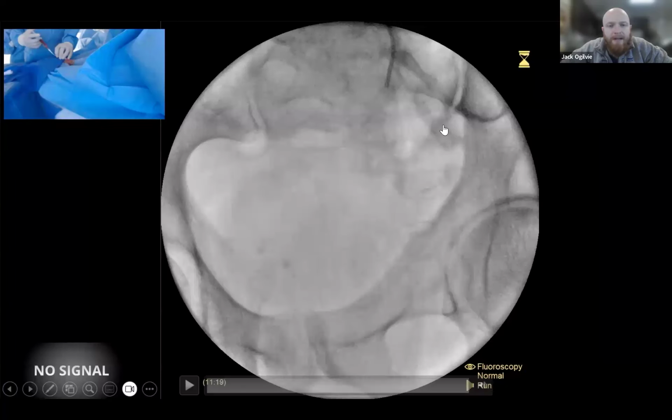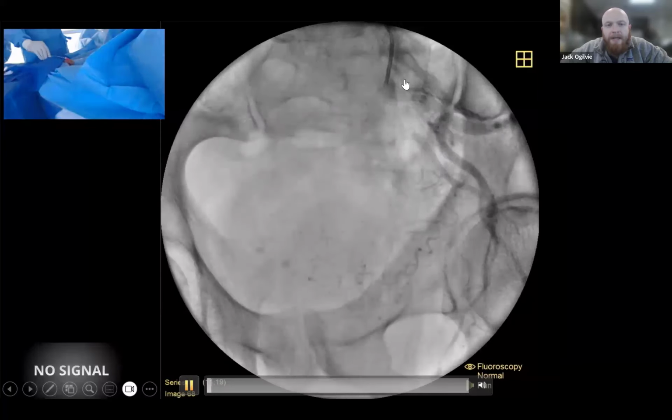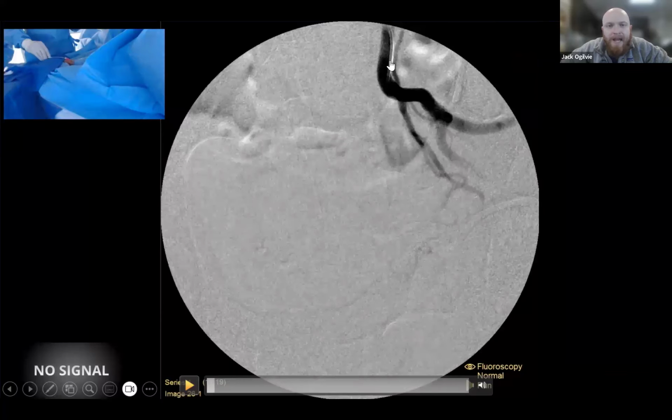And so this is just another image of kind of what I'm actually seeing as I'm doing the procedure. Again, this is after I've gotten into the artery, and this is kind of what my X-ray video feed looks like. And this video plays really fast, but basically I'm in there, and I'll try to pause it here, and I'm injecting the contrast through that catheter, which is in the artery. And so that black is the contrast going into the arteries and kind of giving me this map of where the arteries flow around the pelvis.